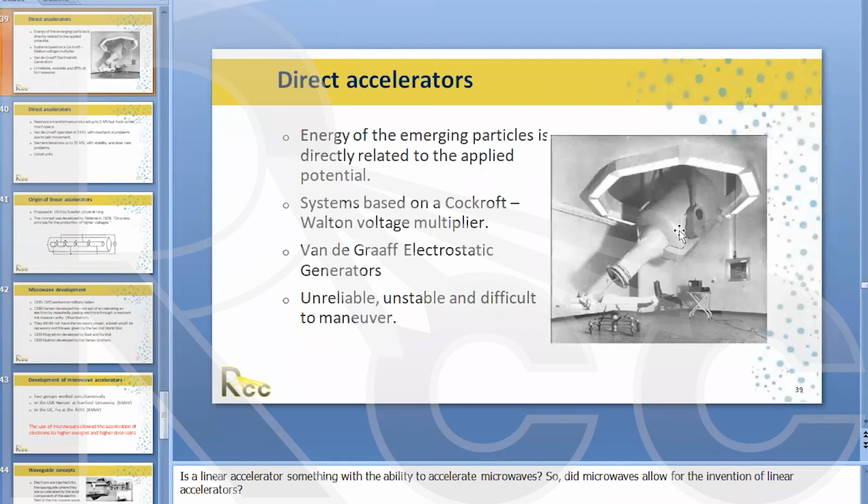In 10 minutes, the patient has to fidget and move. The table's not that comfortable. The patient starts moving, coughing, breathing. Things change, all while the beam is on. The body position is moving. You're missing the target. You may be irradiating normal, healthy tissue.